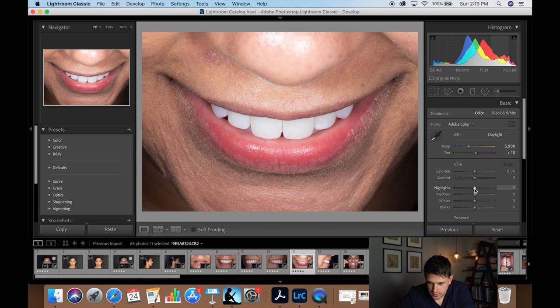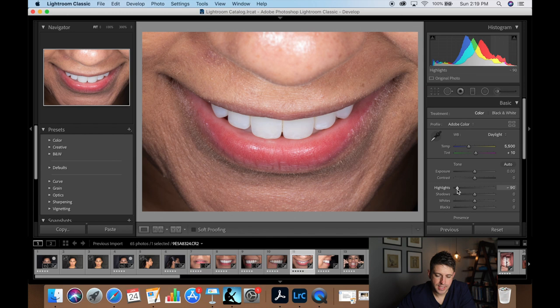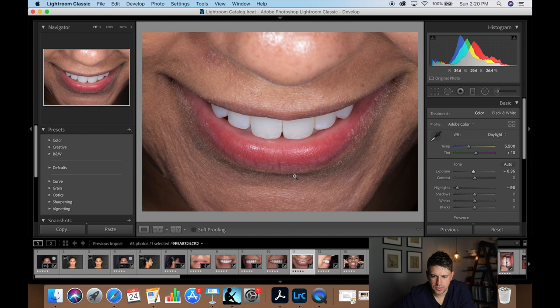Our smile chin-down photo — this is really overexposed, so let's dial the highlights back. It's acceptable to play with exposure but not acceptable to manipulate colors or clone things out of the photo. What we're doing here is pretty mild. I like the composition and position of everything so we're going to keep that.